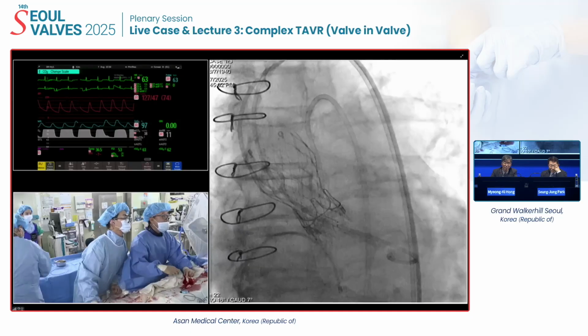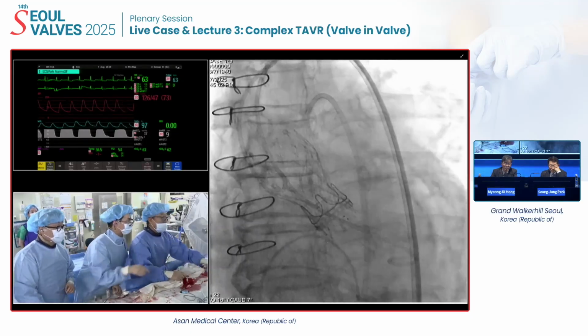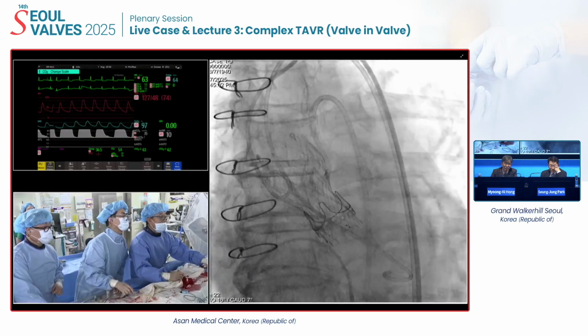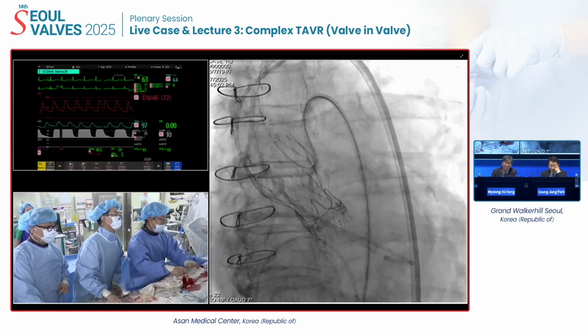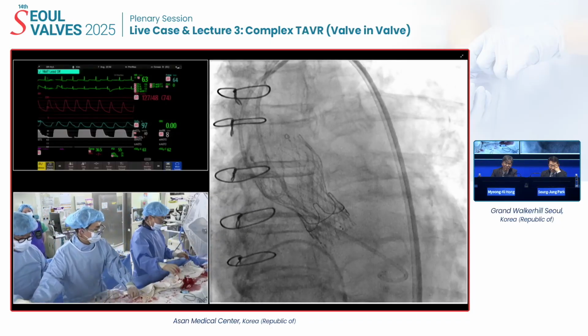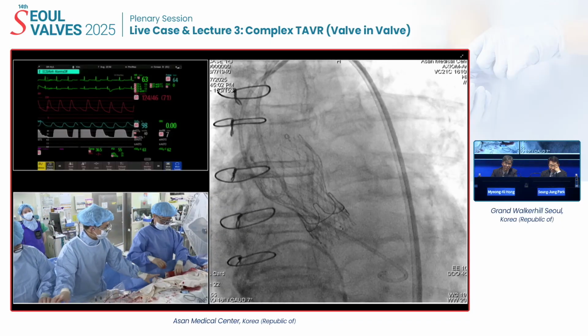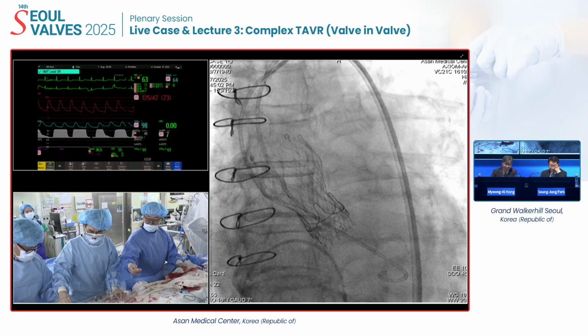줌하고 지금 어디까지 나왔지? 페모랄로 들어가 있지 지금? 네. 잠깐만. 그래서 가운데 있어. 가운데 있지? 오케이. 오케이. And then the remove. And then 요 와이어 주고 LV 빼고 그다음에 파이널 한번 찍어보자. 자, 와이어.